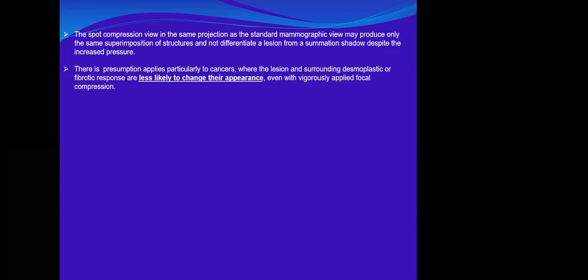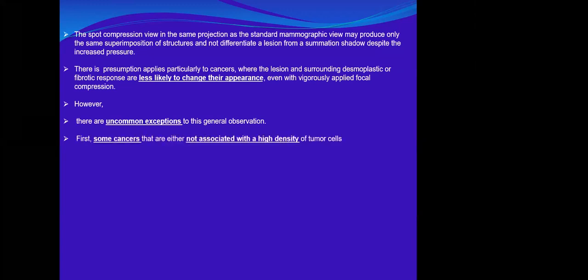The spot compression is more vigorous than the standard compression. It might not change. However, there are uncommon exceptions to these general observations. What are these exceptions?